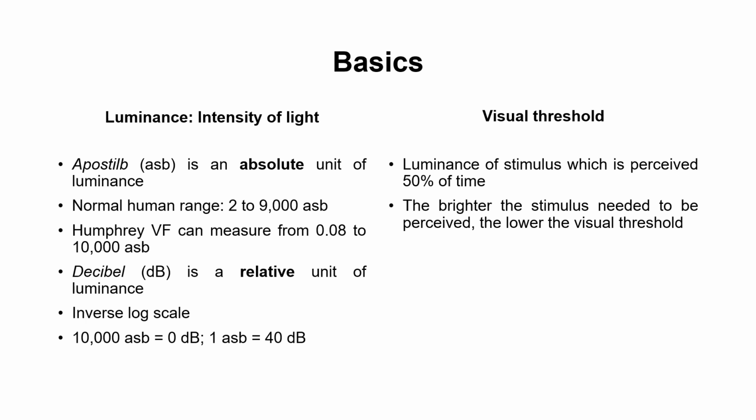However, the decibel is the relative unit of luminance, an inverse log scale. The higher the luminance, the lower the decibel. 10,000 apostilb equals 0 decibel, and 1 apostilb equals 40 decibel.